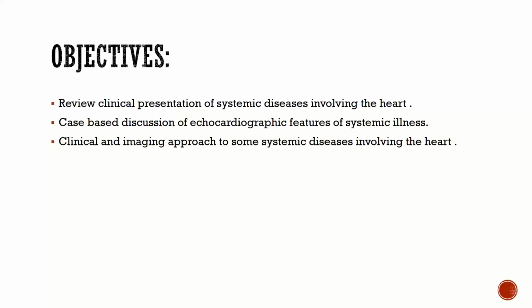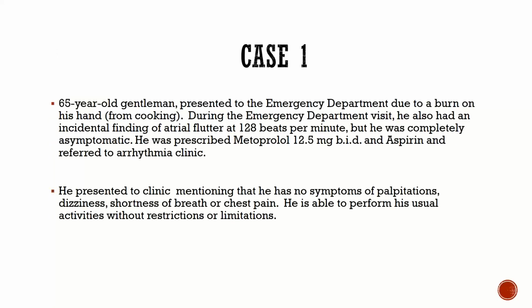So it's all based on 6 cases that I have selected from our black book, and hopefully it will be useful. And I added some discussion about those cases. So what I'm going to do is start the case, and then if anyone wants to give a diagnosis through the chat, he's more than welcome. Okay, so we'll start the first case.